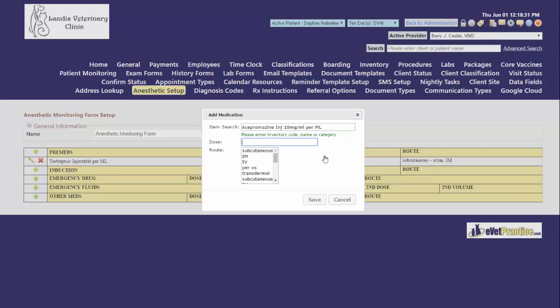You can enter a default dose in this section. All you need to do is enter the number. The system will know the measurement based off of the way the item is set up in inventory and will display it correctly once you click save.